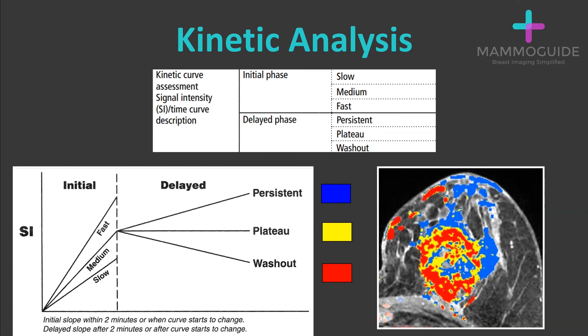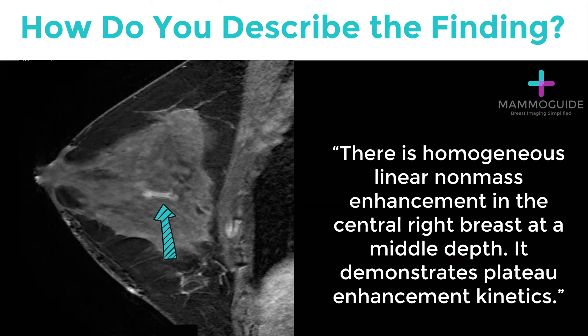This large mass in the central breast is predominantly washout enhancement. Now, putting it all together, describing this finding in the right breast, you would say: there is homogeneous, linear, non-mass enhancement in the central right breast at a middle depth. It demonstrates plateau enhancement kinetics.